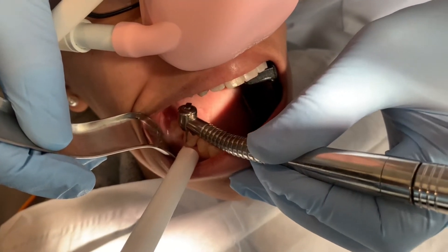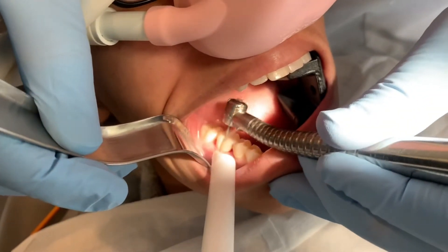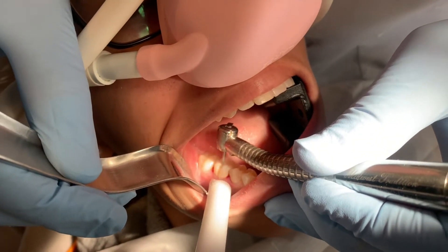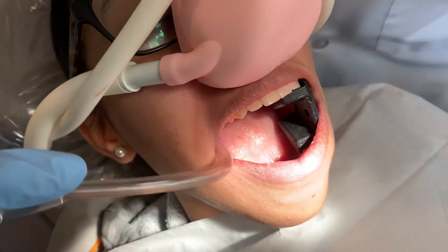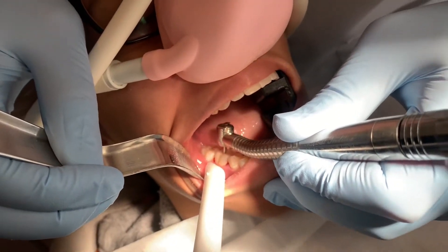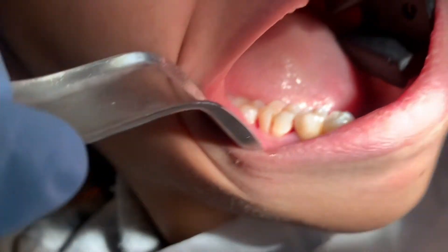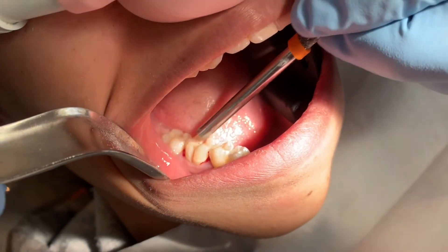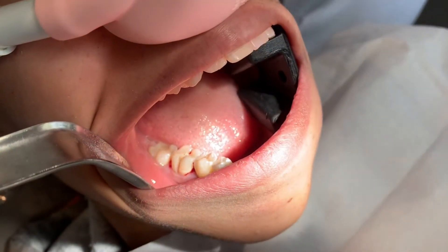Did I hurt at all? Let me know by raising your hand if it hurts, okay? It doesn't hurt, right? If you look down in the tooth — I don't know if you guys can see this — this tooth actually still does have some living tissue in there. That is a lot of blood for a tooth; it's only a few pinpricks worth, but this tooth has probably been hurting for a while.